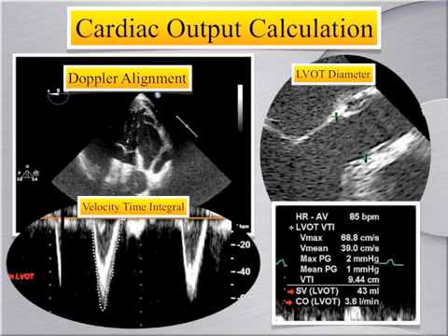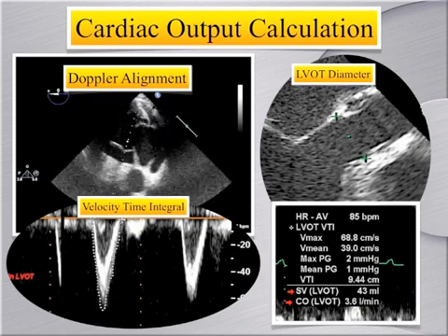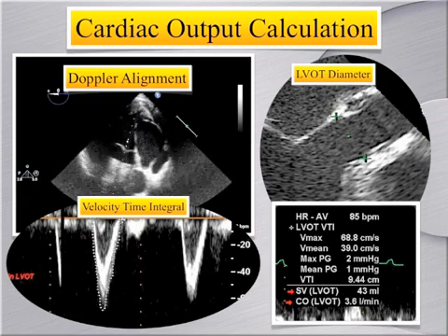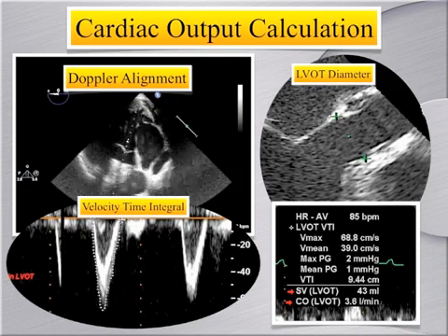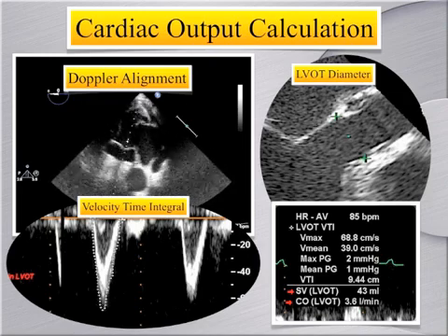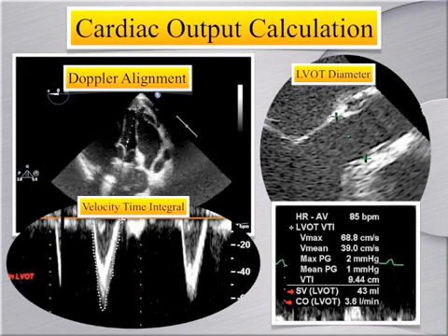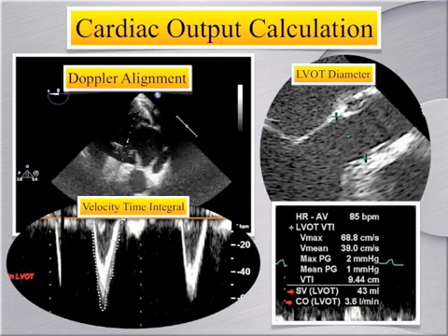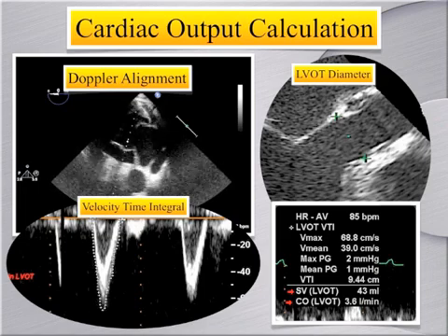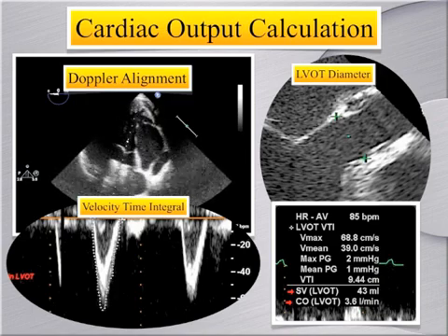Here we have assembled all of the information required to calculate stroke volume and cardiac output. On the left, the Doppler beam is aligned in the left ventricular outflow tract and a pulse wave envelope is positioned within one centimeter of the aortic valve. The hollow pulse wave signal is recorded and a velocity time integral is obtained by tracing the envelope. On the right, the LVOT measurement is obtained in the mid-esophageal aortic valve long axis view with reduced depth. The diameter is measured within one centimeter of the valve during valve opening. A heart rate is calculated from the R-R interval on the electrocardiogram, and the echo machine calculates both stroke volume and cardiac output.